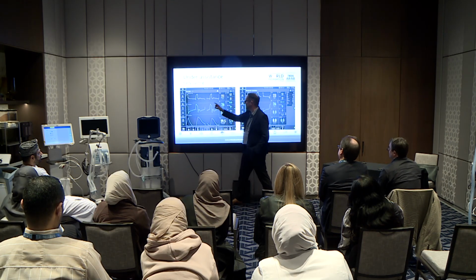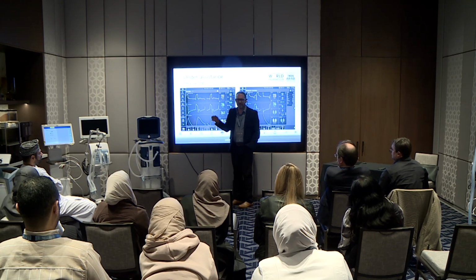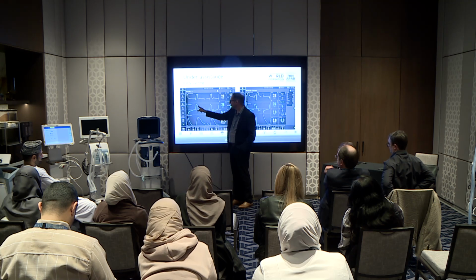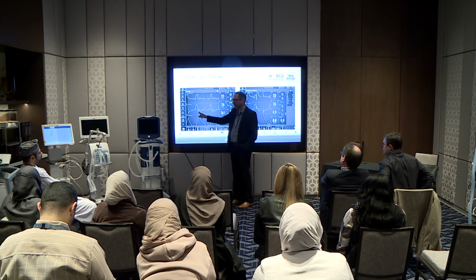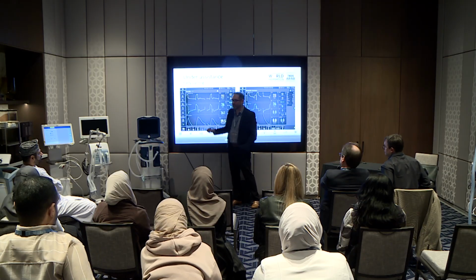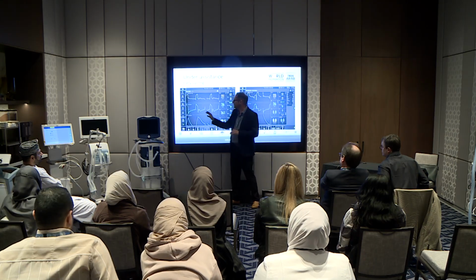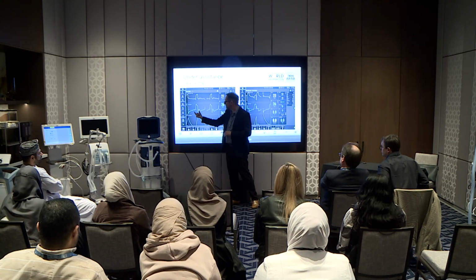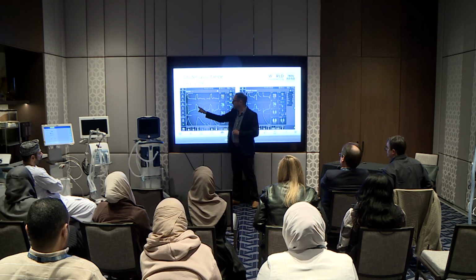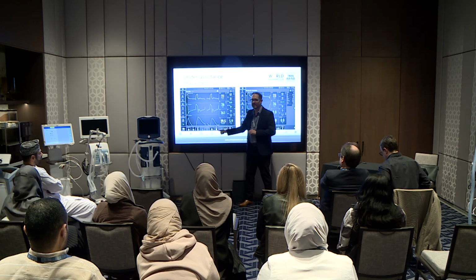Look for the trigger. Does the patient trigger? Yes. Is there work shifting? I mean, it's not very rounded. I wouldn't say this patient's working very hard at all. It cycles off here. You can see the breath stops. But look, you can see inspiratory effort ongoing. Now, I heard you say trigger. What is sometimes confusing is some people say that and go, oh, it's ineffective trigger. What you have to assume without esophageal pressure is that this and this are part of the same breath. It's an assumption you have to make because it's so close and because it seems to be cycling off very early. This is my inspiratory cycle percent.